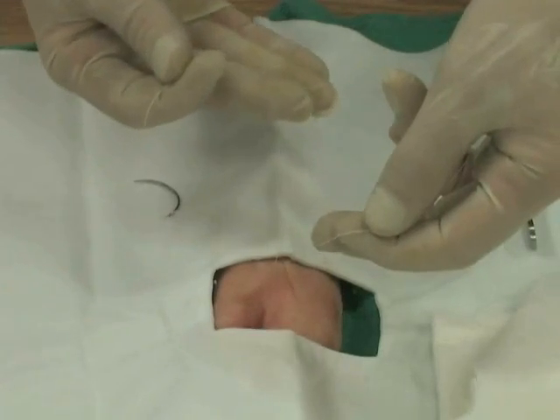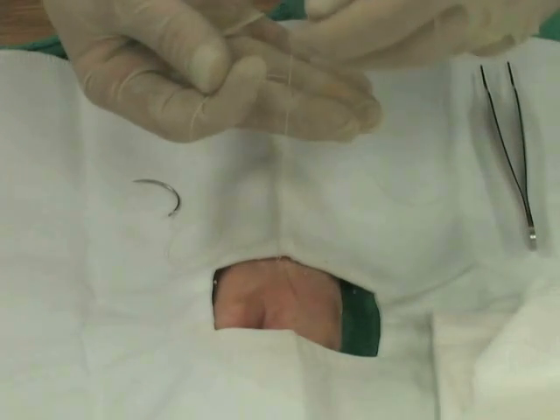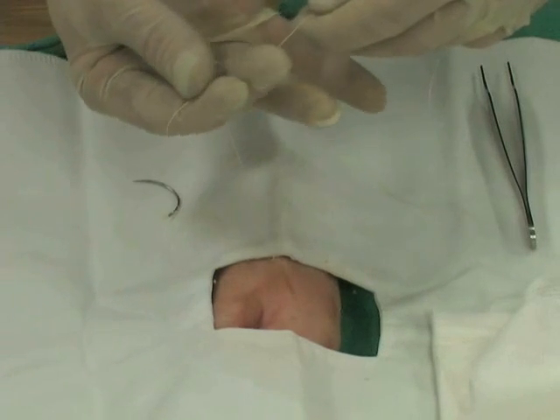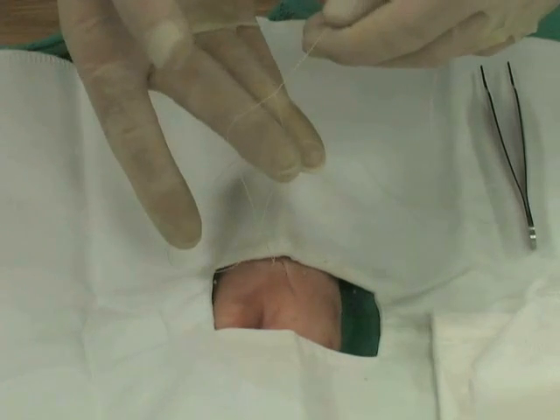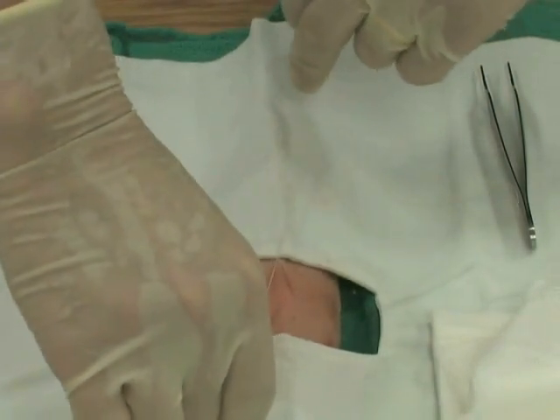For the second half of the one-handed tie, pinch between the thumb and the forefinger with the short end. Pull the long end over the third finger, bend, grasp the short end with the third and fourth digit, pull through the loop, and lie the knot flat.